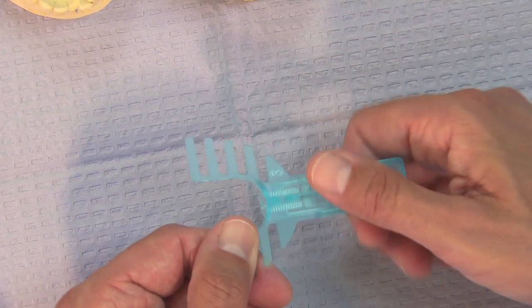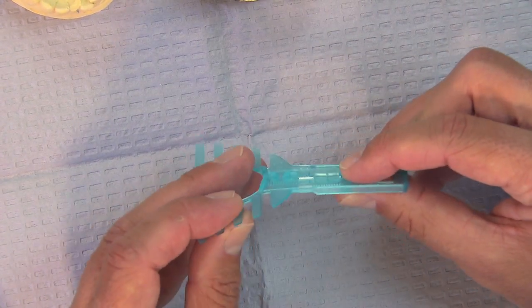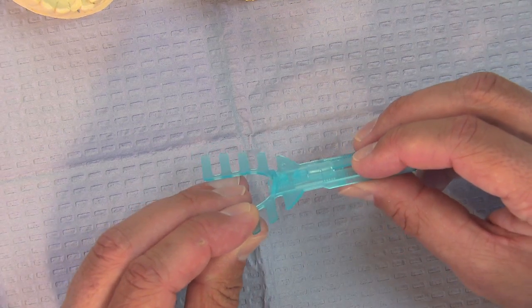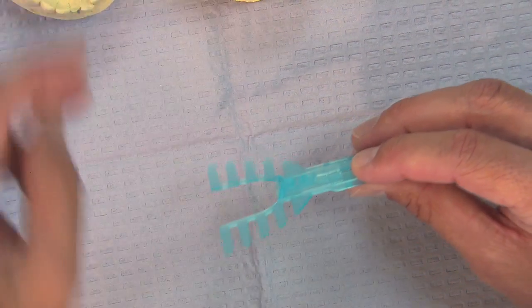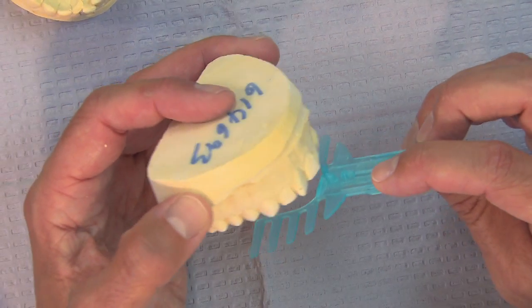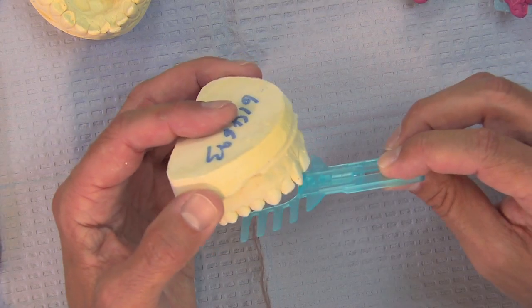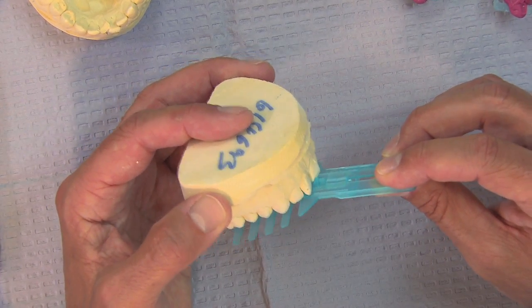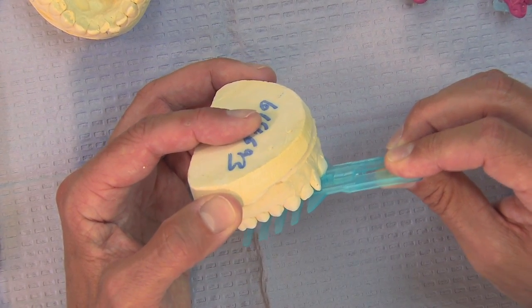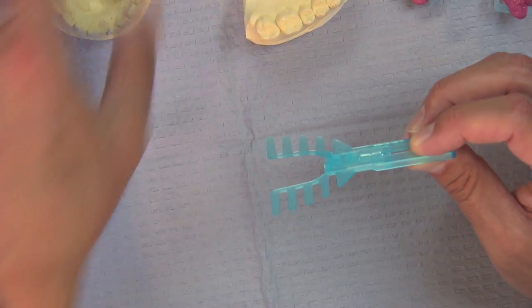You'll notice on this protrusive gauge there's a top part that slides back and forth with the little lower notch down here. So basically this is how we're going to measure the protrusion in the patient's mouth. So I'm going to use a model here just to show you. When the patient bites into this, teeth number 8 and 9 are going to go into this gauge on the top. You can see this little notch right here. And the patient's going to bite into that notch. And so that's going to remain in place as they do that, as we do the protrusion.